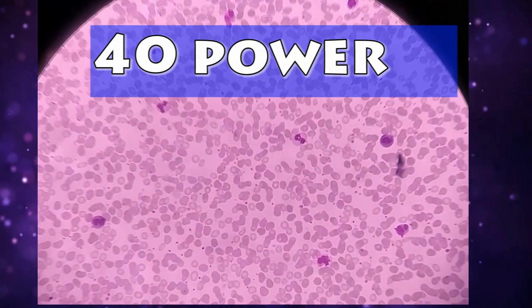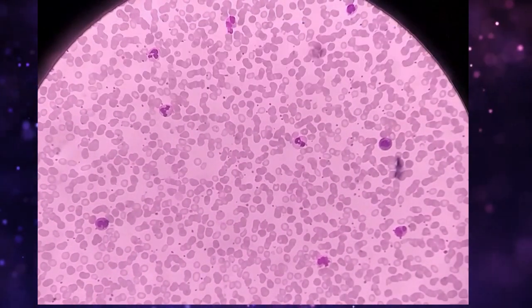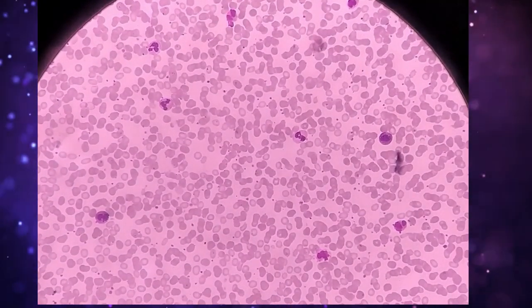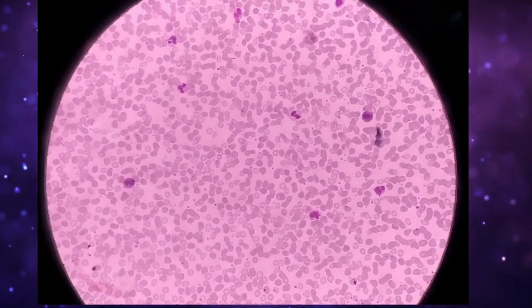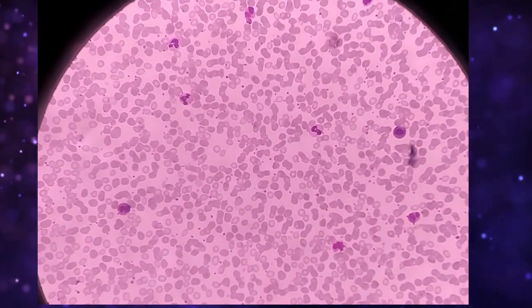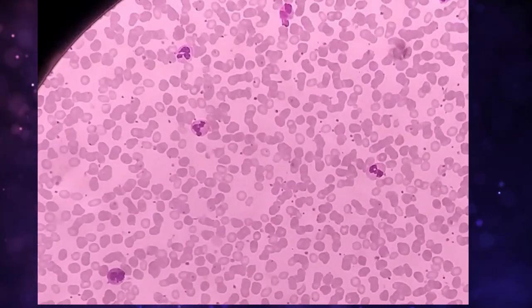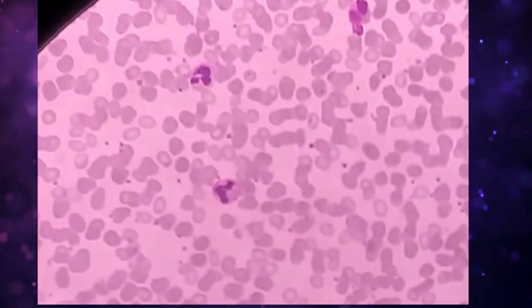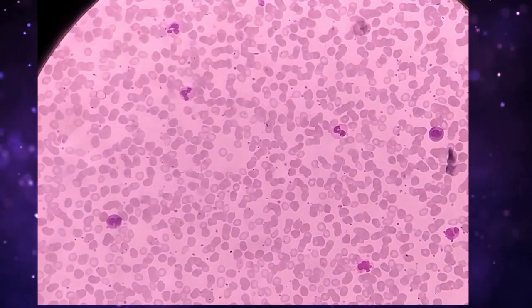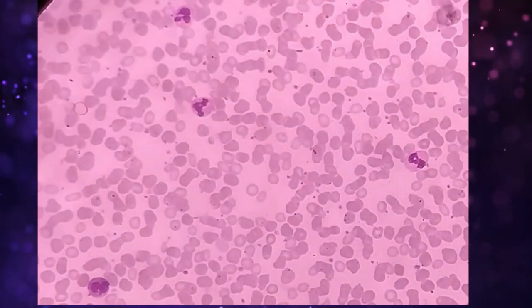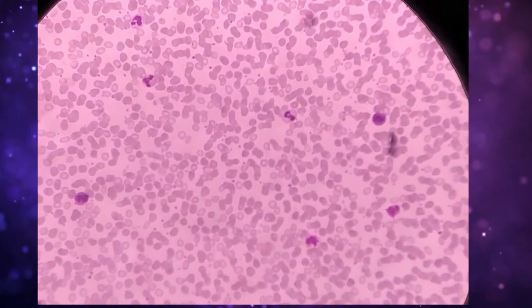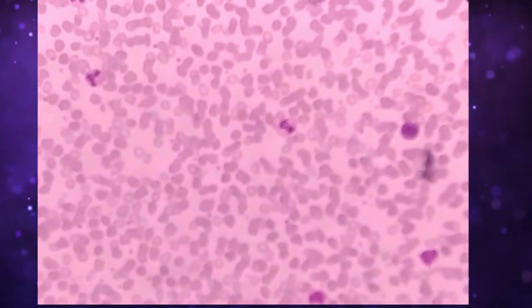Here you can see a lot of white blood cells, not only neutrophils. Count how many neutrophils are on this smear, on this field. I can see three neutrophils. Let's see one by one. This is the first neutrophil. This is the second neutrophil. This is the third neutrophil.